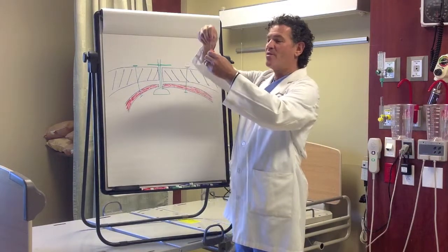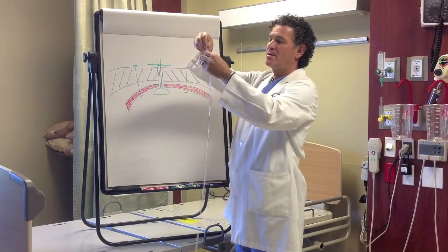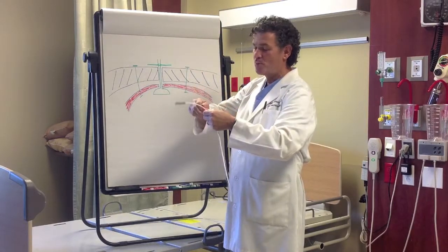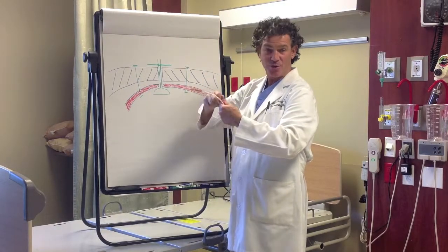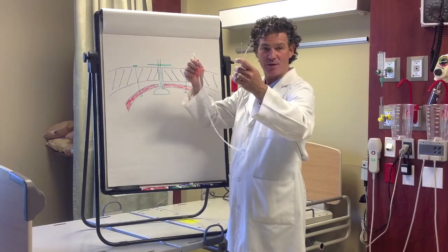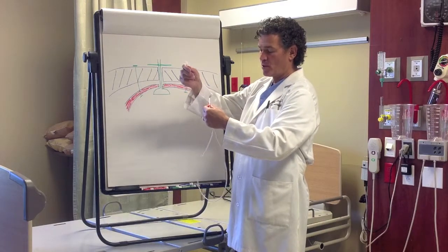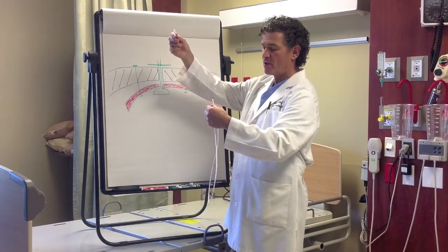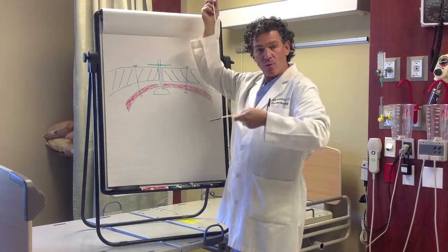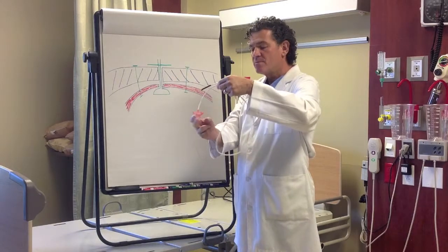The guide wire then can be put back into the tube, and then you can reinsert the tube. You never want to push this guide wire back into the tube if this feeding tube is inside the patient's body anywhere, okay? The other thing that's important with these tubes is when the guide wire is removed, whether the tip of the tube is in the stomach or whether it's in the small intestine, the tube becomes very flexible.